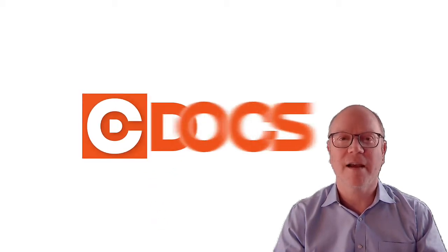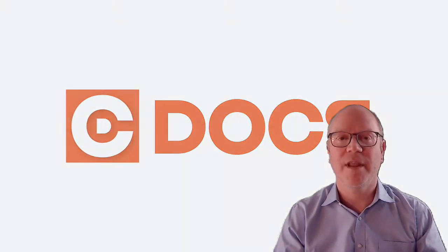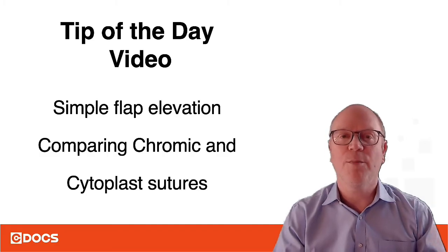Hi, this is Dr. Doug Smail from C-Docs, and today's tip of the day video is on simple flap elevation and comparing chromic and cytoplast sutures. The dental form we're going to use for the flap is the same one we use for CI2, so you can get familiar with that.